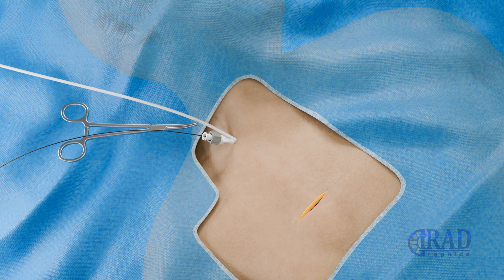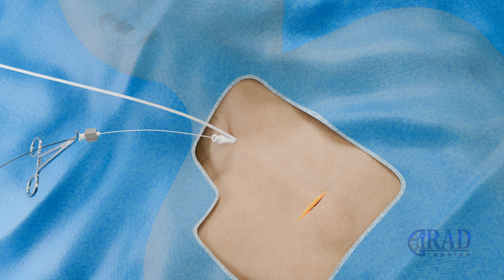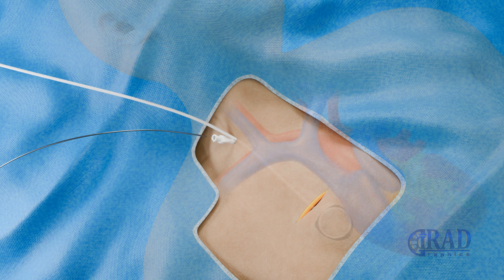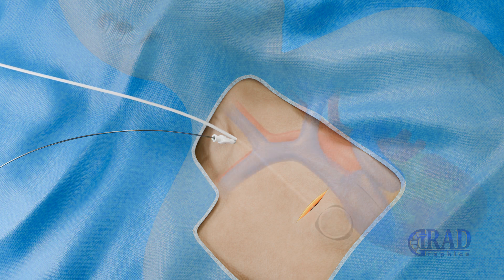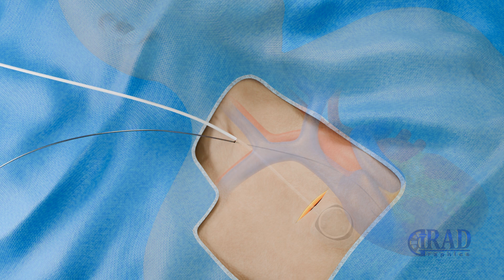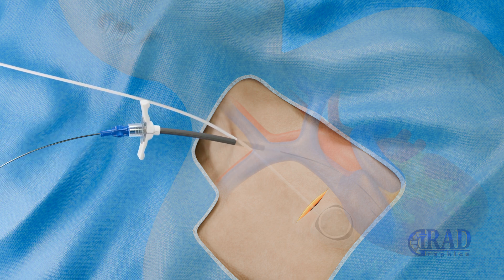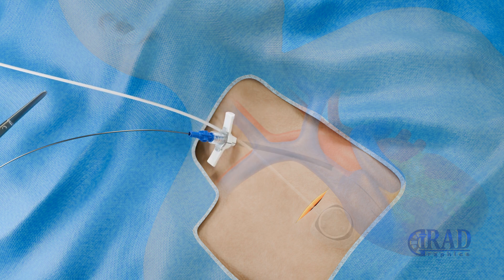The endovascular length of the catheter is measured using the existing microwire as a reference. The microwire and inner dilator of the transitional sheath are then exchanged for a J-wire. Next, the outer portion of the transitional sheath is exchanged for a peel-away sheath, which facilitates catheter placement.